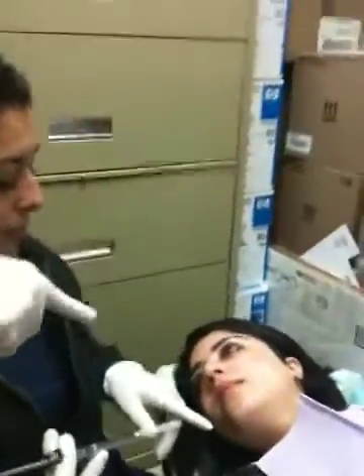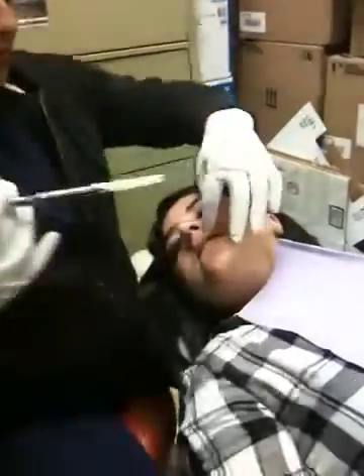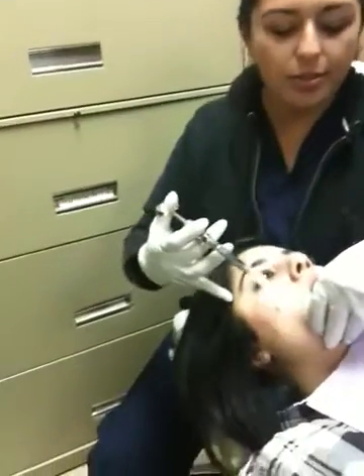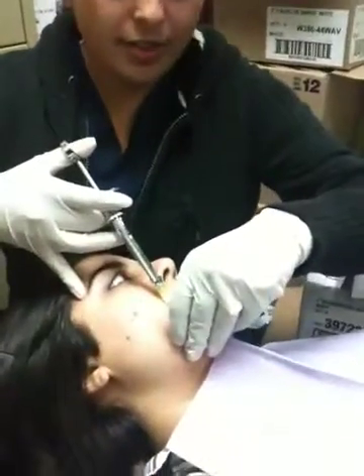But if you're going to give just an infiltration, you've got to follow the long axis of the tooth, remember? So how are you going to do that? There you go — I wanted her to figure it out, critical thinking, you've got to figure these things out. Try a little bit towards me. There you go, right there — that's good.